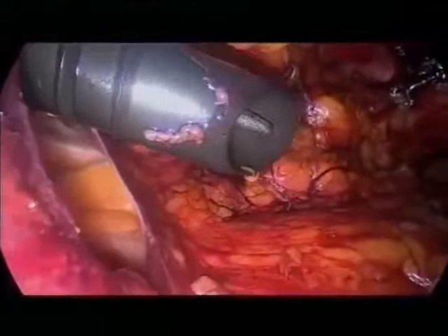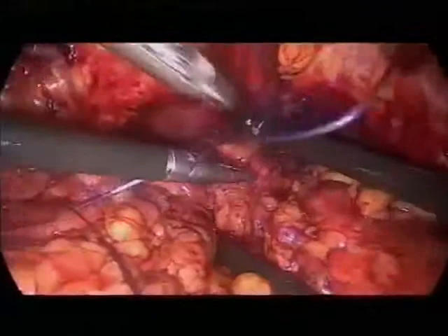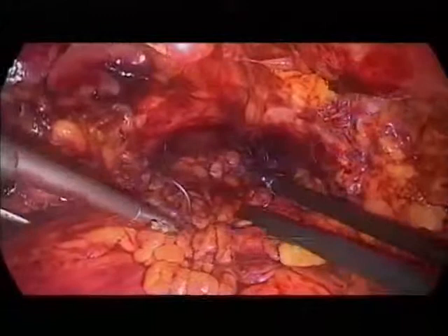As long as the patient is sufficiently muscle relaxed by the anesthetist. Probably this is important to know. And in Trendelenburg, of course. No, just 10 degrees Trendelenburg. It's a very good anesthesia here. Not only very beautiful, it's also very good. Okay, and then we use the same needle. It's not cut.